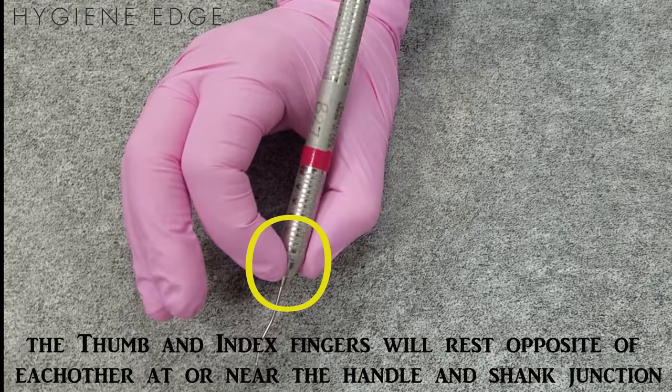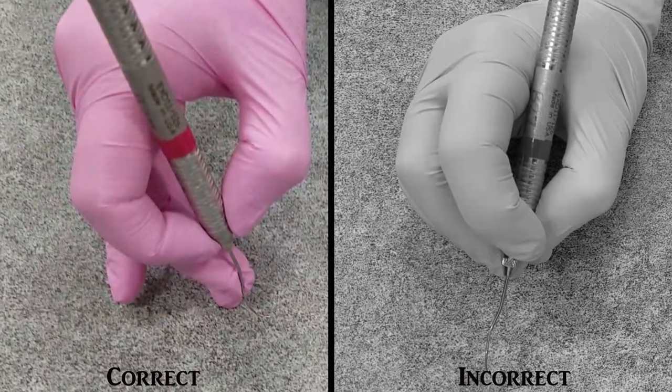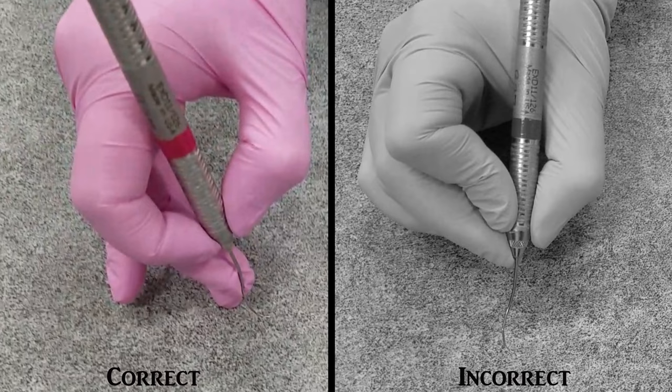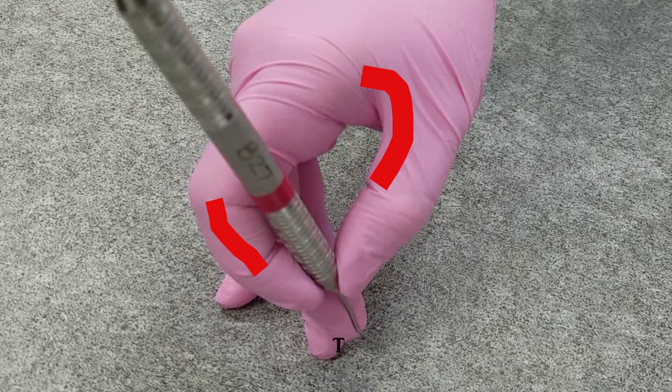The finger pads of the thumb and index finger rest opposite each other at or near the junction of the handle and the shank. The fingertips shouldn't be touching, and the joints should be relaxed and shouldn't be hyperextended. The handle will rest between the second and third knuckle, and shouldn't go beyond this range.